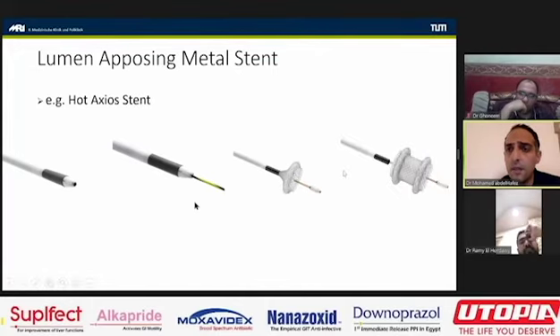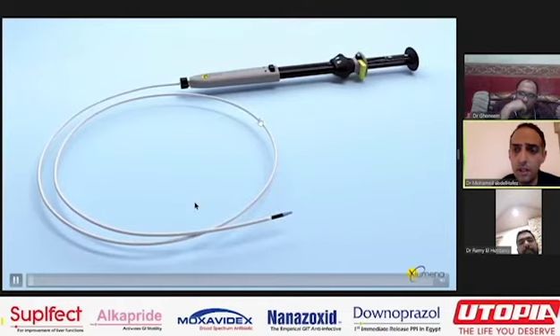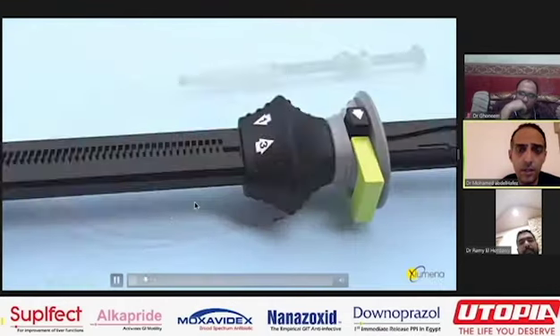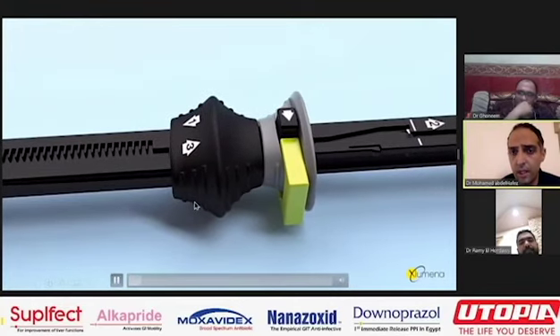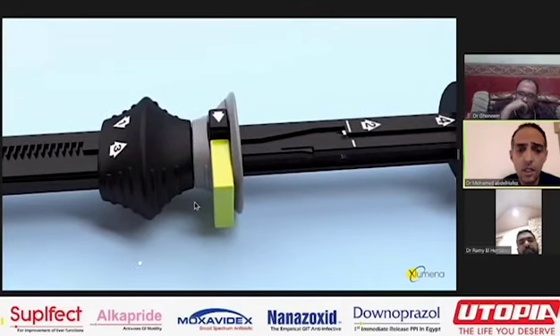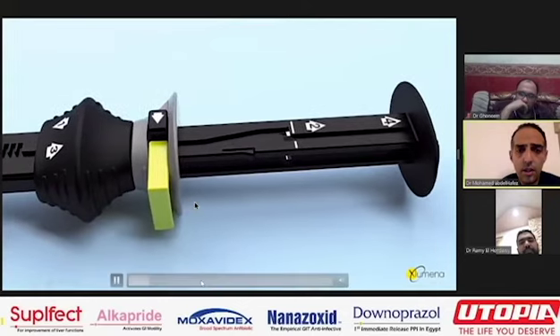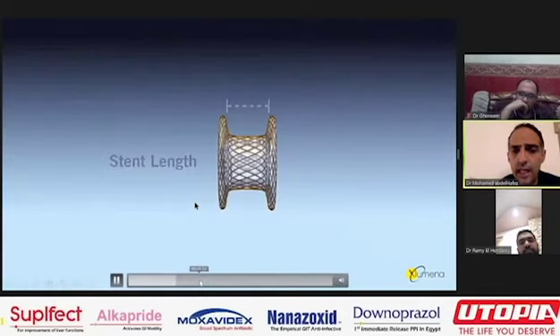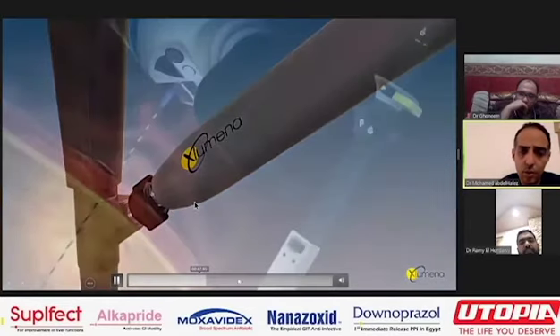And I don't know if you can see it now, but anyway, I will play a video now that will show how to use it. This video you can also find on the internet. It is from the company. So it has a handle. This handle has 4 marked steps from 1 to 4. You put it exactly like the fine needle inside the endoscope.